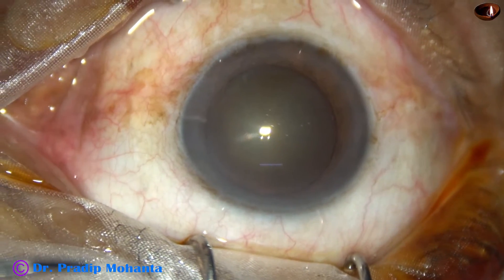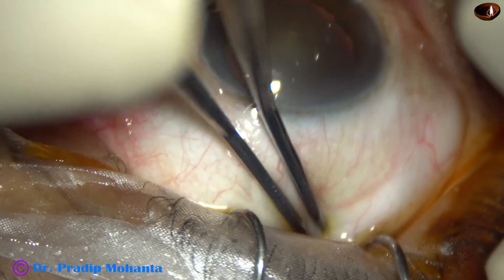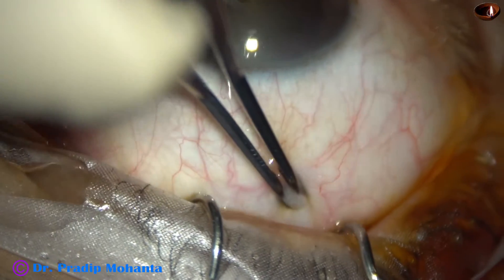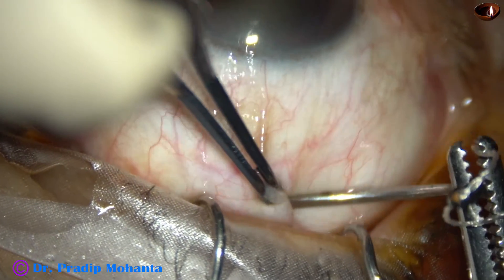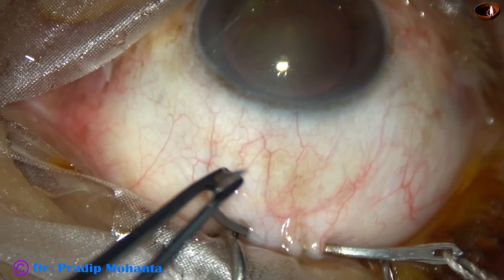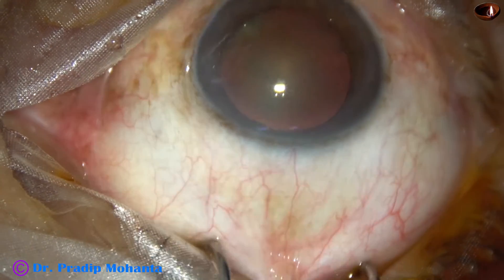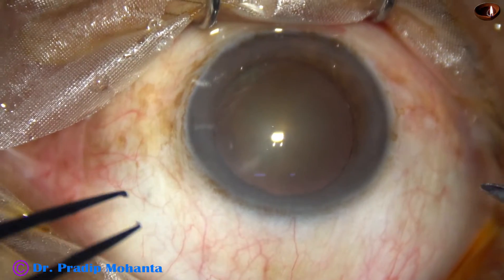The eyeball is turned down with the help of a muscle hook and the superior rectus tendon is caught hold on. I failed to catch at the first attempt but could catch at the second attempt, and now a superior rectus bridle suture is applied. This helps a lot in making the sclerocorneal tunnel, keeps the eyeball stable throughout the tunnel-making procedure, and helps a lot during nucleus delivery.